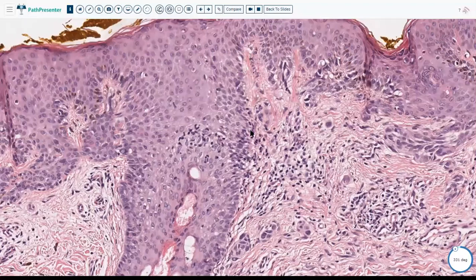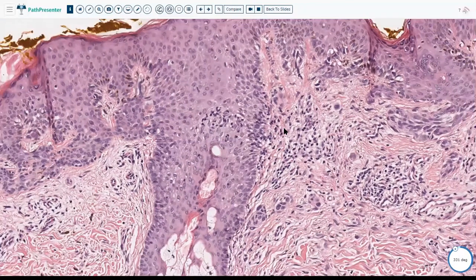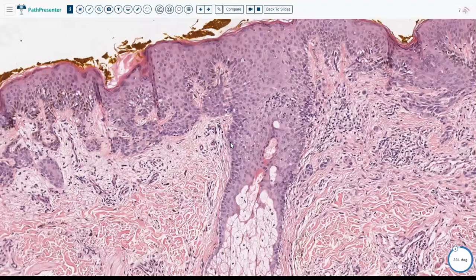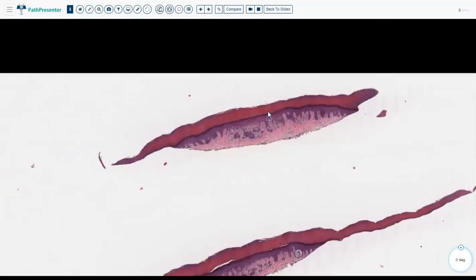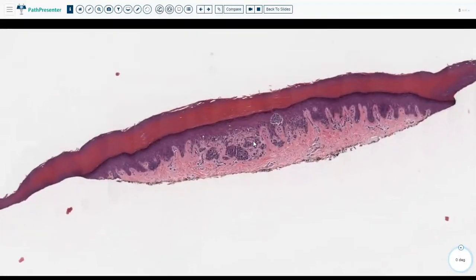So we have these terms in order to express sometimes histological difficulties and not being able to call it neither a nevus or a melanoma. Okay, so moving on to our next example. This is not a different condition as much as it's an important pointer for you to know. There's something we call nevus of special site or special site nevi.